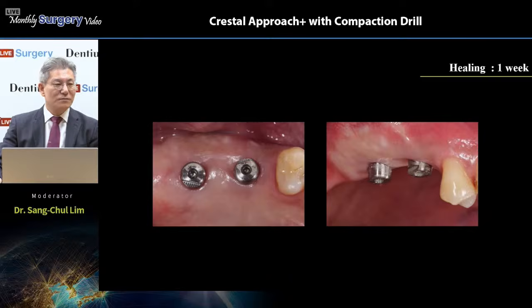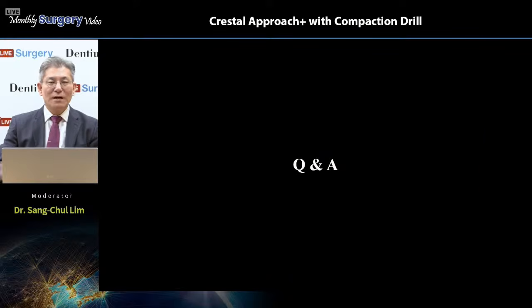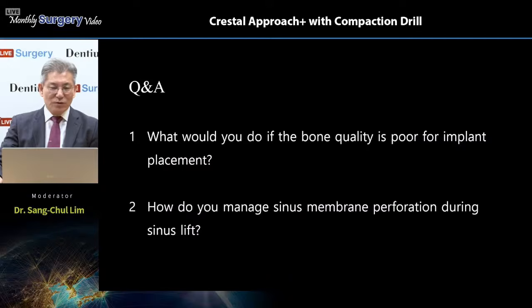That is natural. Okay, let's move to the Q&A session. Today we have two very nice, very good questions. Number one, what would you do if the bone quality is poor for implant placement?